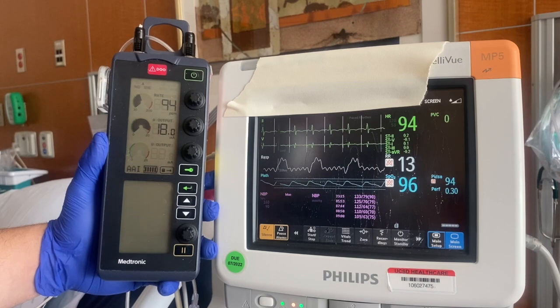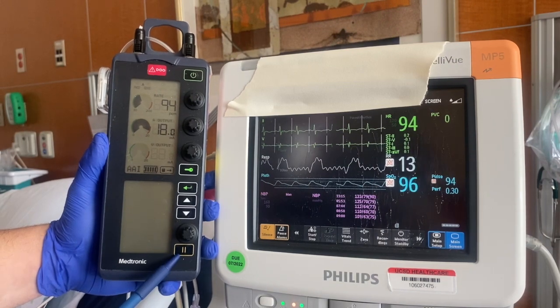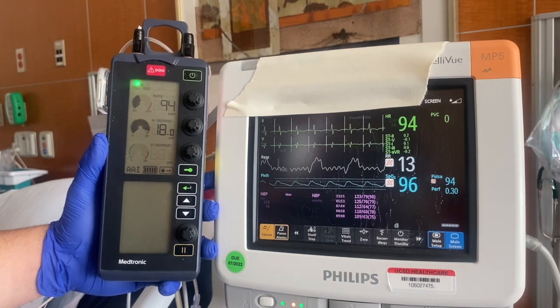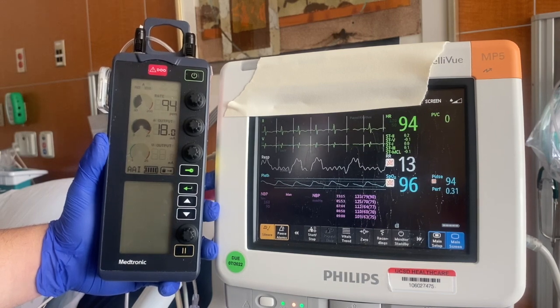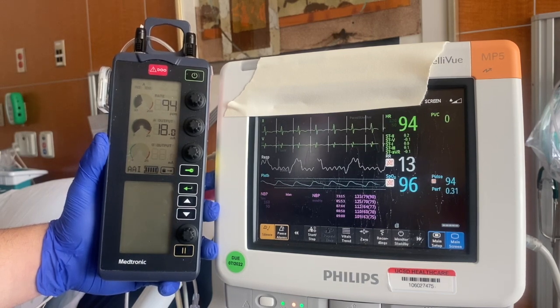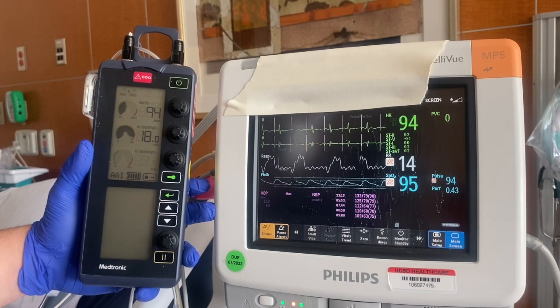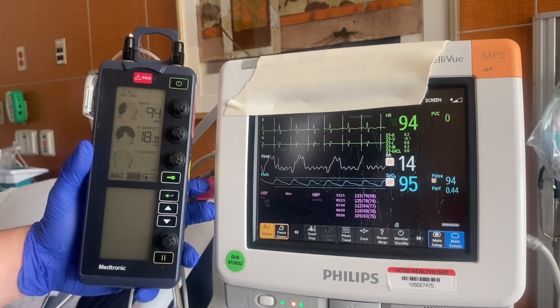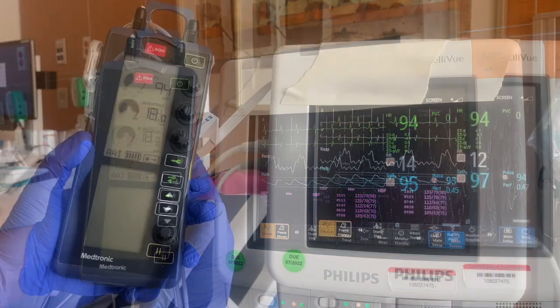There is a pause button at the bottom, but we are going to go through an underlying rhythm check. Before we do that, we need to make sure that the patient is stable. After you've ensured that the patient is stable enough, we are going to check the underlying rhythm.